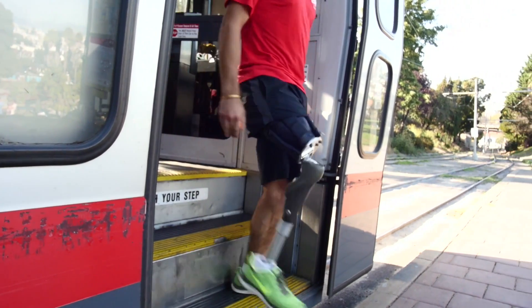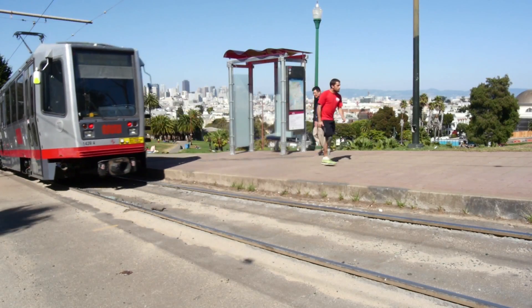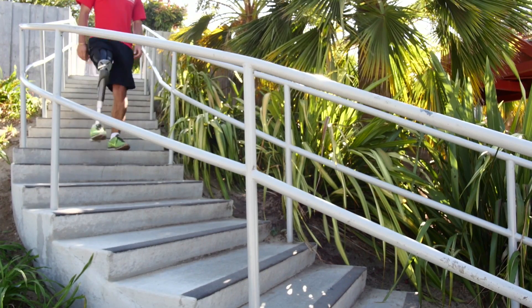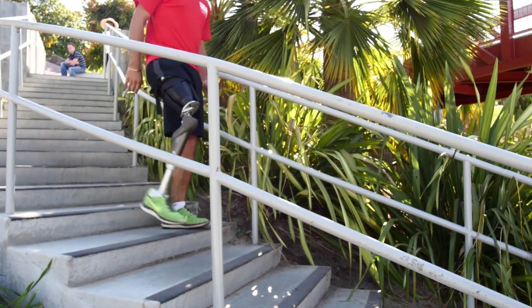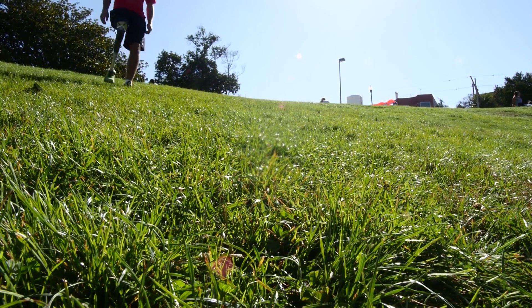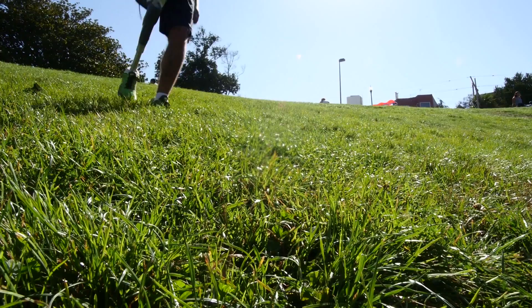The first time I put it on, it felt like a shoe or a baseball glove — something that you would want to put on every day — and I walked all over San Francisco. Companies like Limb offer good proof that design isn't just about creating some fancy new object; rather, it's about finding the right problem to solve, and in this case, solving that problem immediately improves a life.